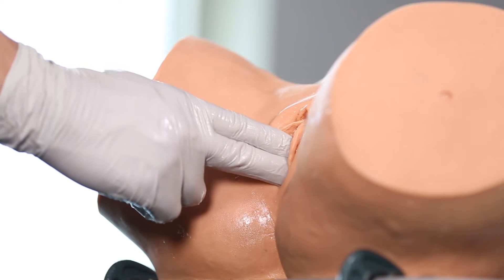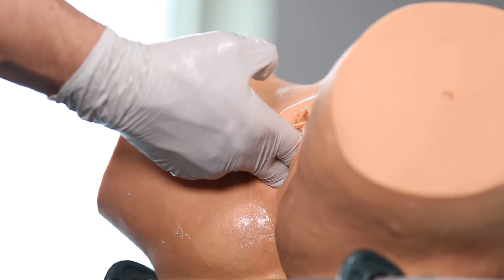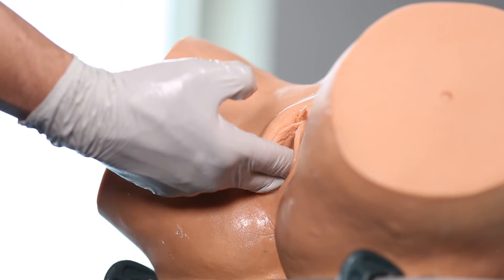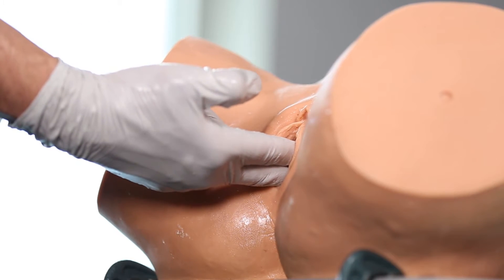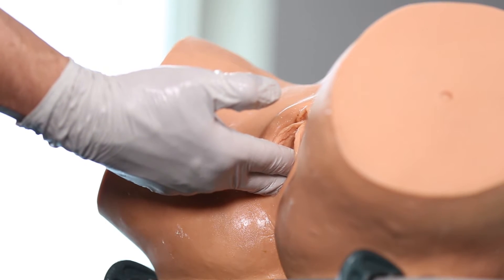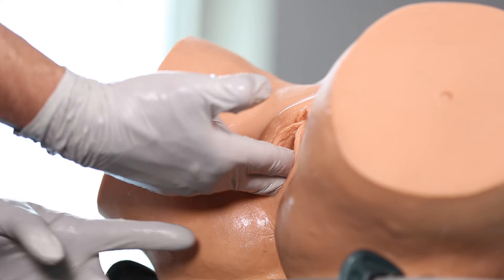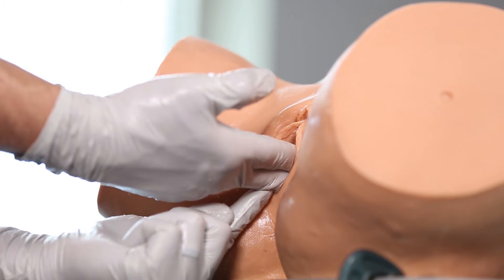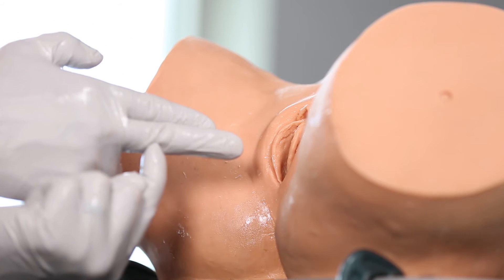Step number one is to check the position and station of the baby. In this instance, the baby is right occiput posterior at plus one station. I find the flexion point three centimeters forward of the posterior fontanelle along the sagittal suture. I rest my hand on the perineum and determine from the middle finger to that part of my hand is approximately eight centimeters.